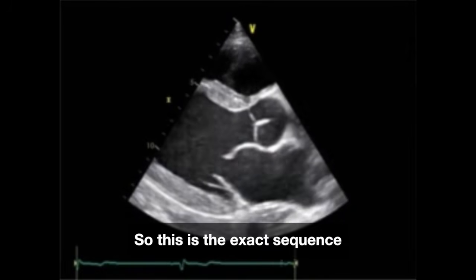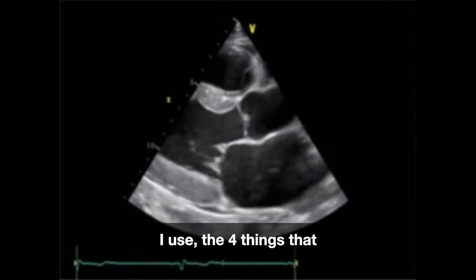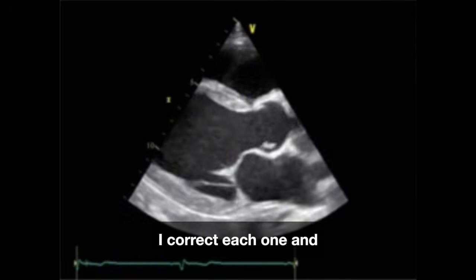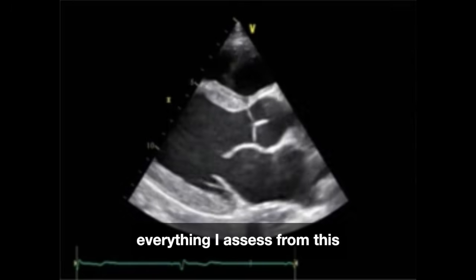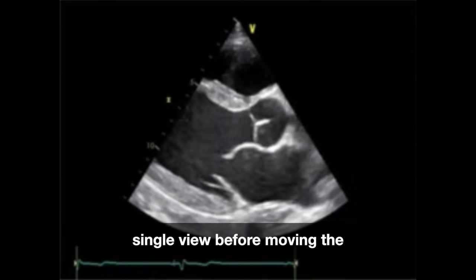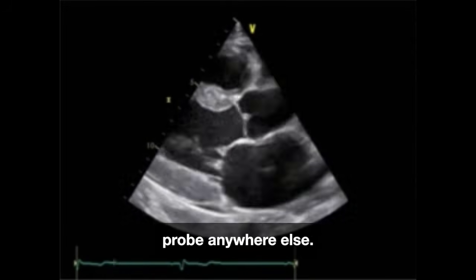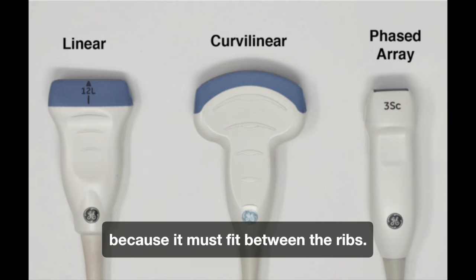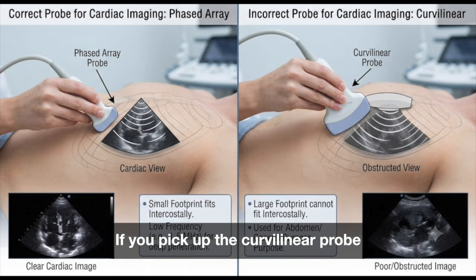So this is the exact sequence I use, the 4 things that commonly go wrong, how I correct each one, and everything I assess from this single view before moving the probe anywhere else. Probe: phased array probe, low frequency, and a small footprint because it must fit between the ribs. If you pick up the curvilinear probe that you use for the abdomen, you will not get through the intercostal space.